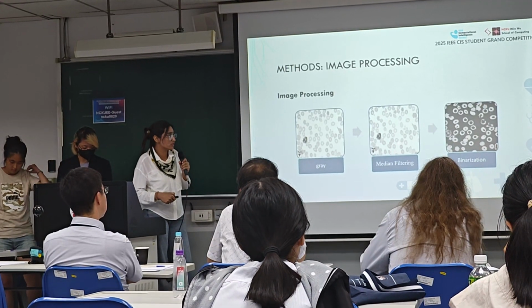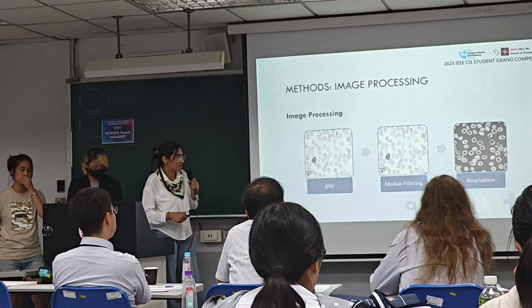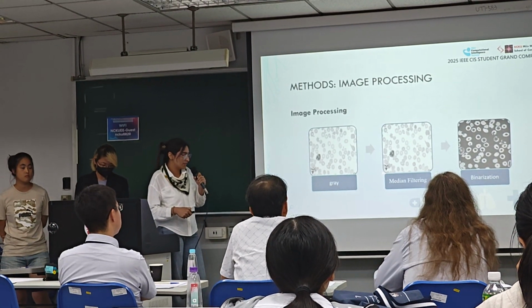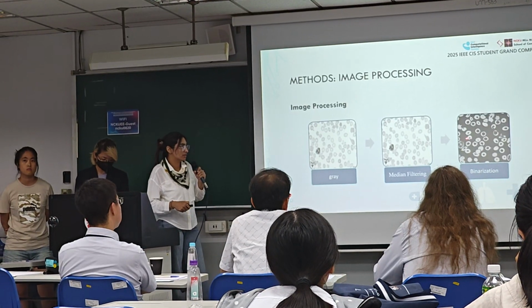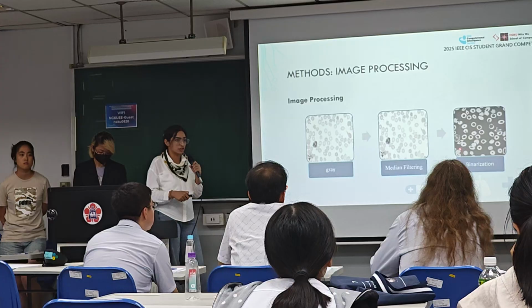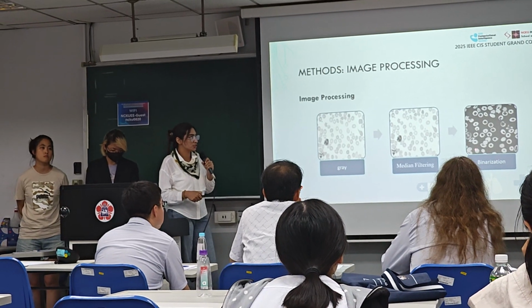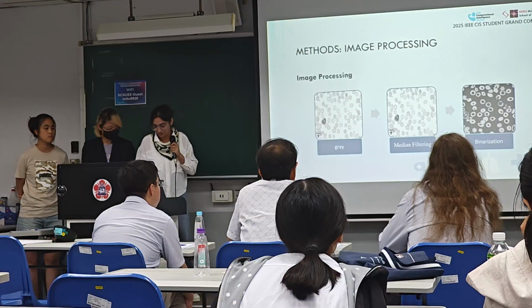it enhances the image quality so that it preserves the details inside the cell and also outside the cell, because the cell has a cell membrane. This process also maintains the image quality. And then we convert it into binarization. Binarization converts the image into just black and white instead of the colored picture. We use analysis on the colored picture, but for the AI training module, we convert it into binarization to distinguish between the background and the cell, what actually the cell is.